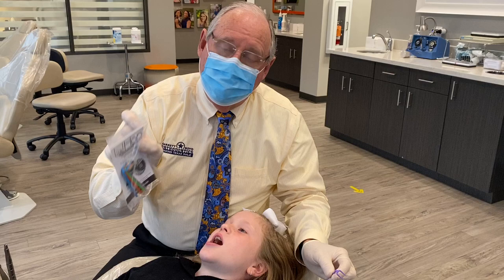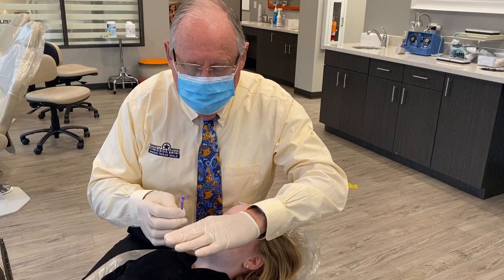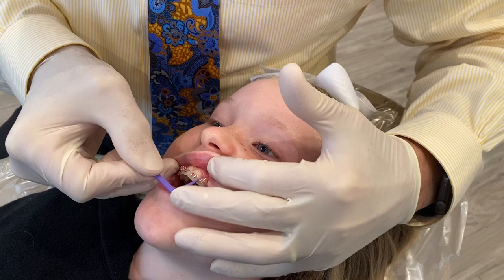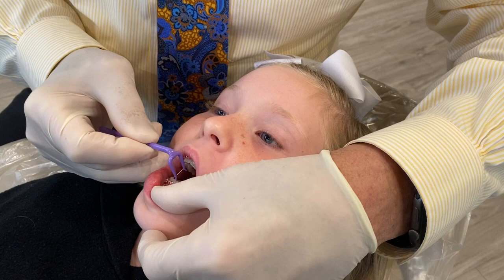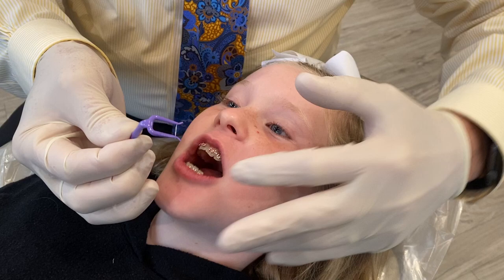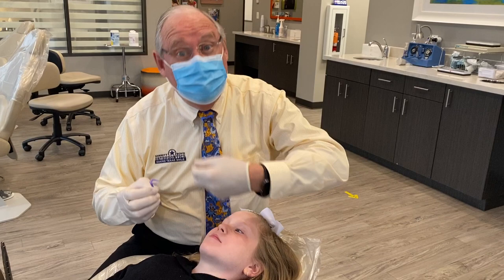The unique part about it — if you'll look up close, it has a shape like a little heart. But watch this. When you get ready to floss, this little area fits right underneath the wire, and you can get right in between the teeth and it comes right back out. It's great in the front, it's just so easy. And over here on the side, open up just a little bit bigger, Kennedy — you can actually do the back teeth also. This is so superior to regular floss or some of the other flossers where you have to thread them underneath the wire.